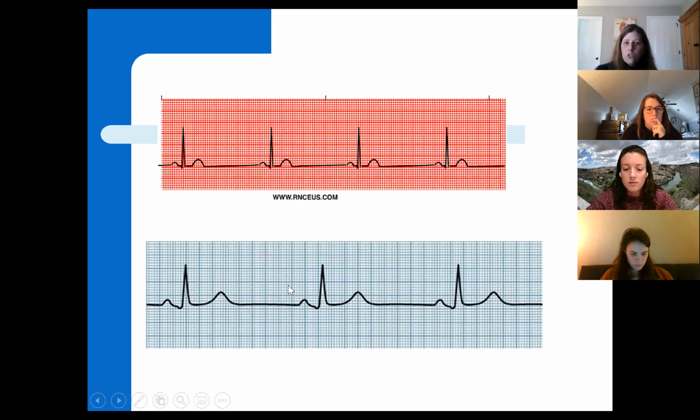Same thing, the voltage is going to be the same. There's not going to be EKG strips that are different in that, oh, this company provided us with 5 little squares by 5 little squares high inside each big box, and this company provided us with 8 wide by 8 high. That's not going to happen. It's going to be the same in the grids. We're not going to try and trick you. That's not the purpose of this.